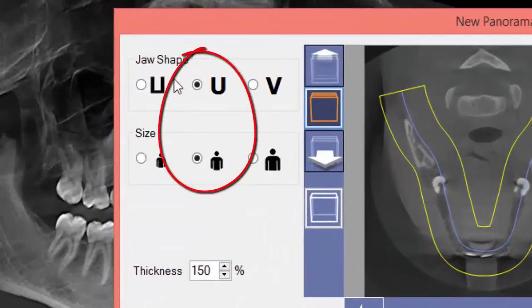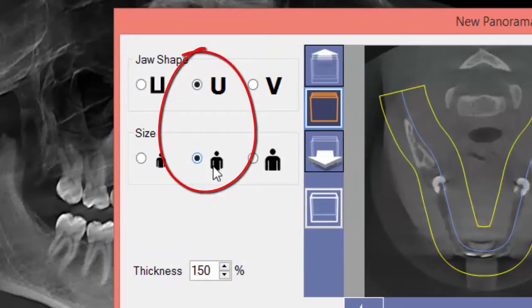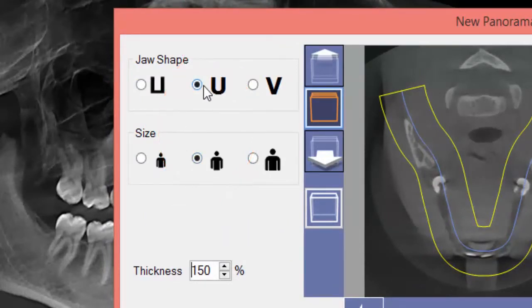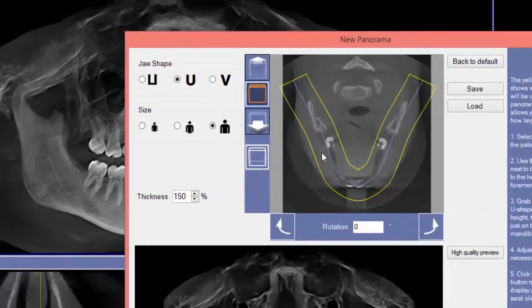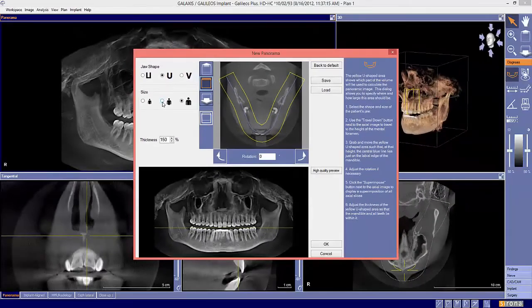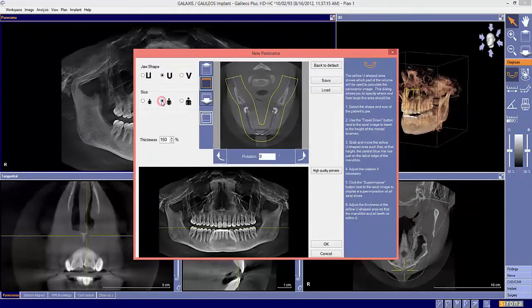You'll notice the default is the U-shape and the middle patients. I'm going to ask you to select the larger patients, which changes the panoramic curve. Did you notice the change? I'll go back.